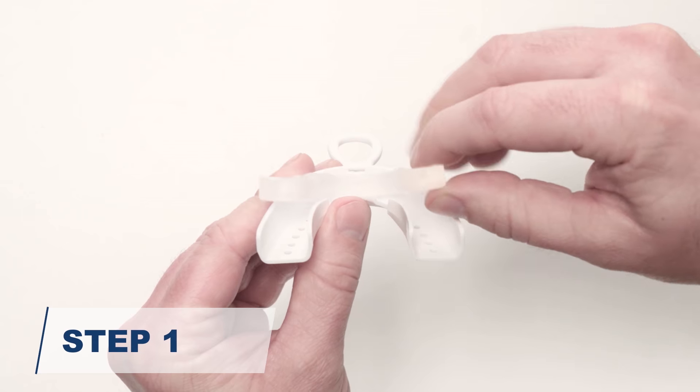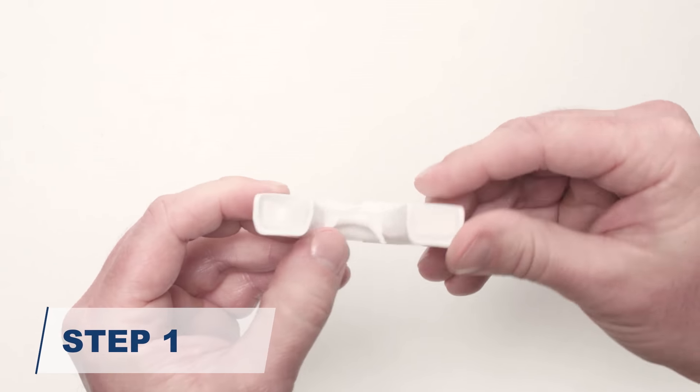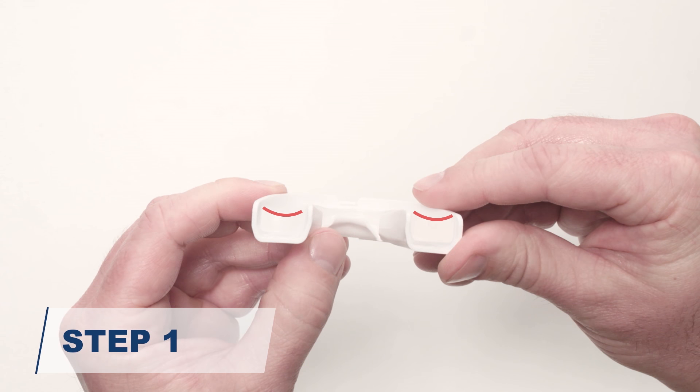To begin, make sure to place the dental guard correctly into the fitting tray. The guard is positioned correctly when the top of the dental guard is concave, as indicated by the red lines on the screen.